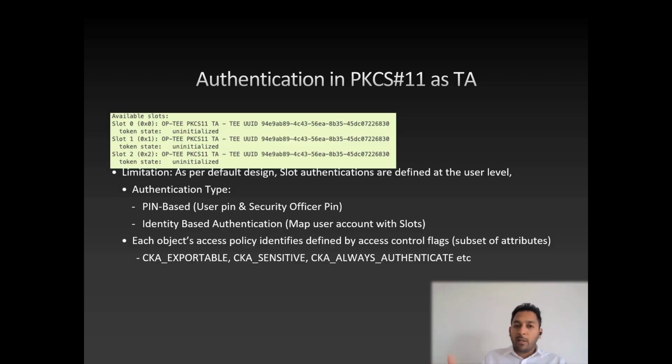Then it will let the application call in. So that's what's called the user pin. And there is another set of pin called the security officer pin. This is basically an administrator user that's responsible for changing user pins, etc. Both of these pins should be saved and stored securely.